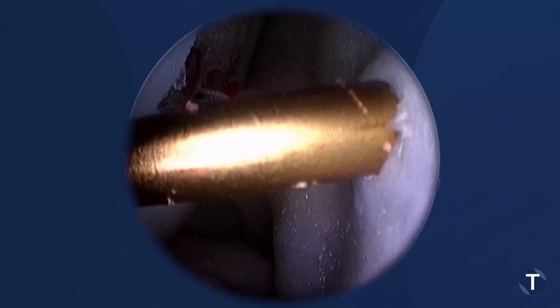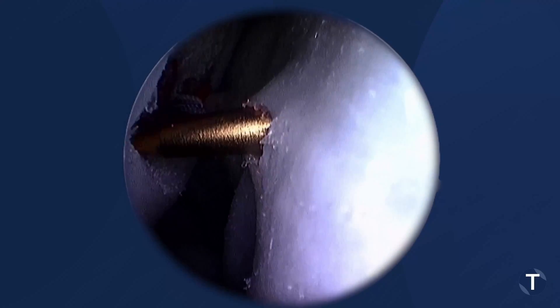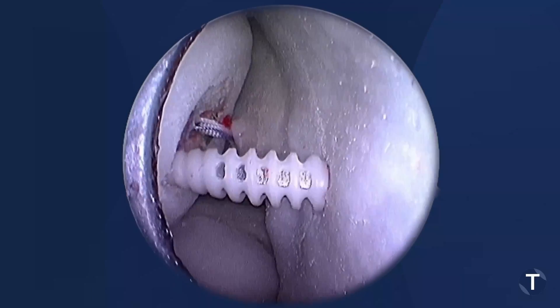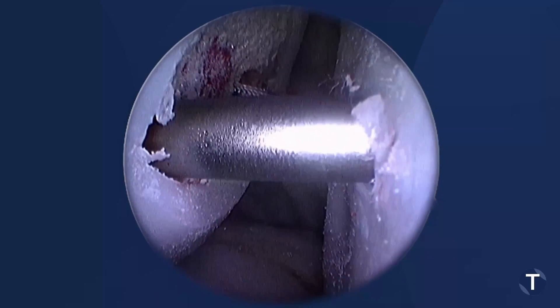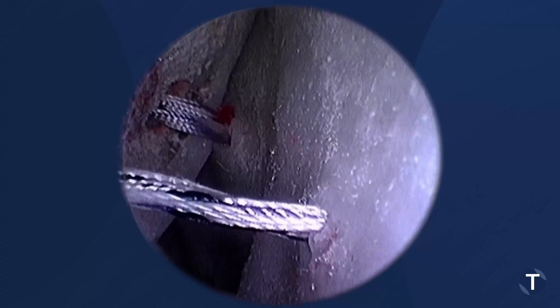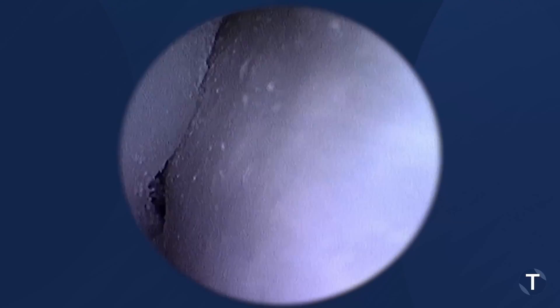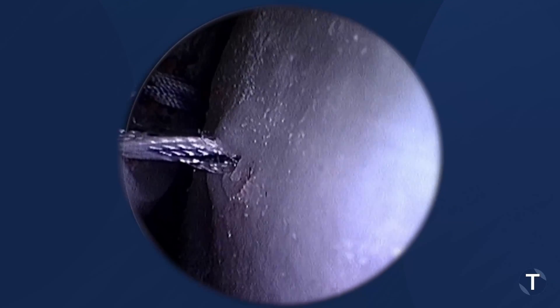We're going to put this right up against the articular surface at the superior aspect of the Hill-Sax defect. We're going to insert that anchor in the superior hole. We like to put the anchors in at the very beginning when the humeral head is still subluxed anteriorly, so you can actually see better posteriorly. You can see if I just tension those sutures, how it shifts and implants the posterior capsule and cuff tendon into that Hill-Sax defect, making it extra-articular. That's going to be our so-called remplissage at the end of the procedure.